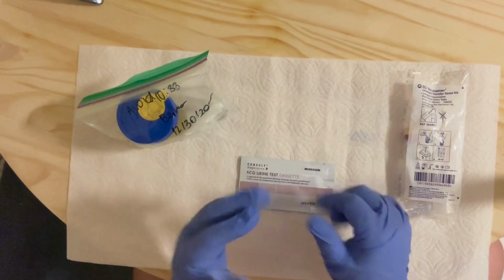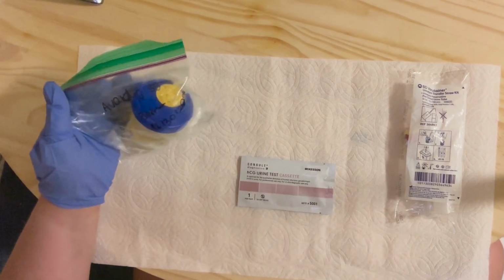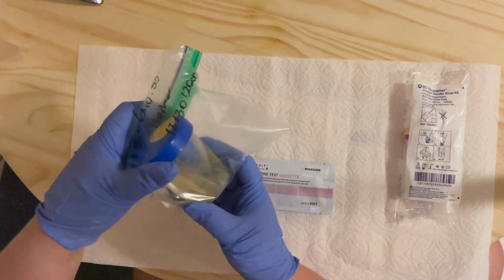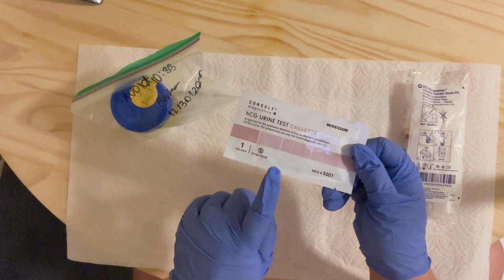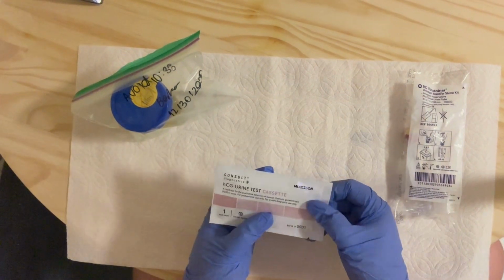Now, to properly perform a urine test, here I'm showing that I would go ahead, open the package of the urine kit, check the expiration date.